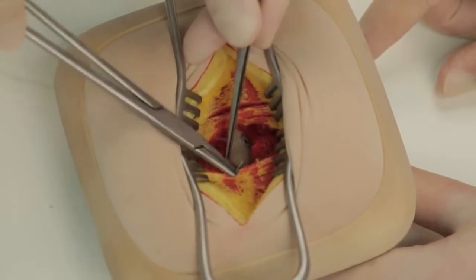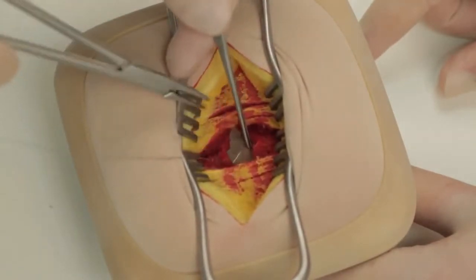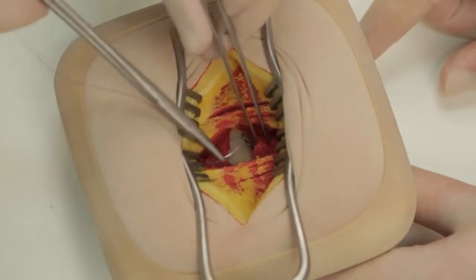Loose, interrupted stitches should be used to oppose the muscles of transversus abdominis and internal oblique.